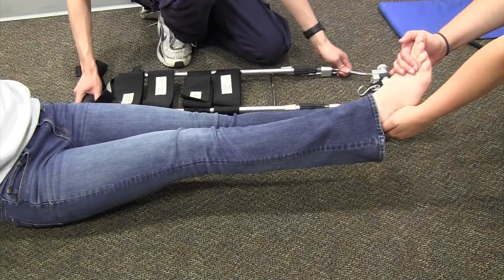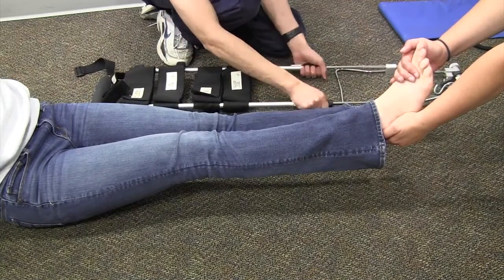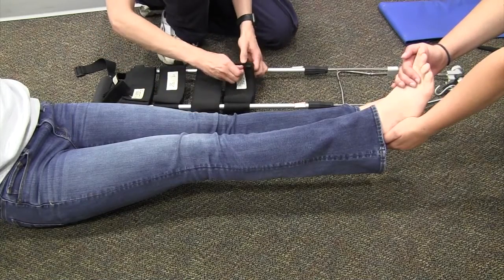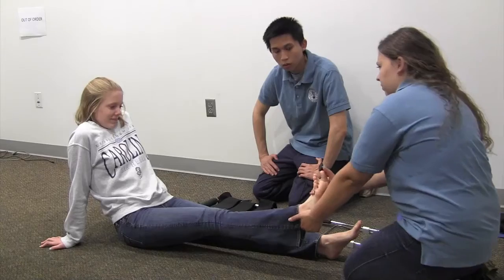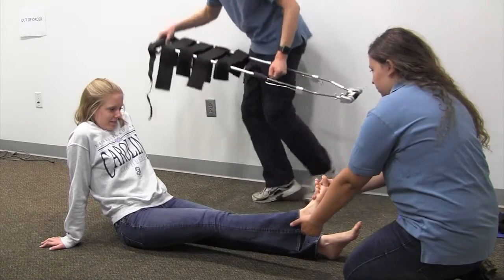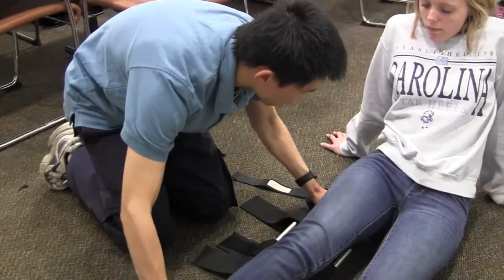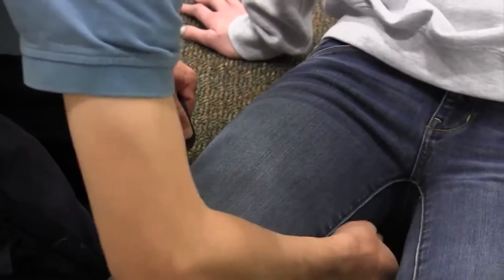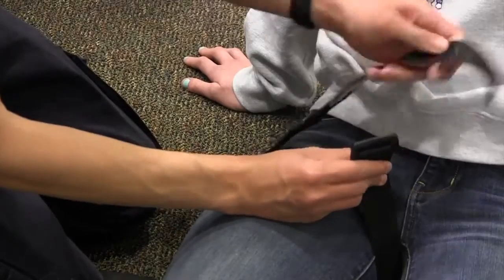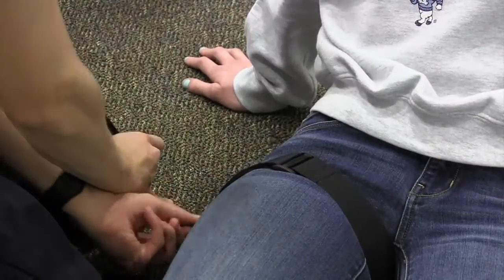We're going to measure the length of the traction splint a good length beyond her uninjured leg, tighten up the dial, and prepare the straps for her injured leg. I'll carefully move the traction splint over to the injured leg and place it under the injured leg with the top part right under her ischial tuberosity — right under the curve of her butt. Then I'll take the ischial straps, place them as high as possible on the thigh, and tighten as much as possible.